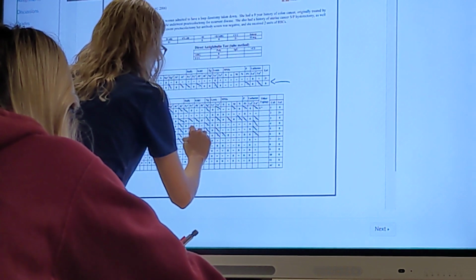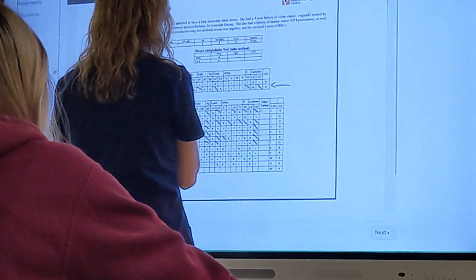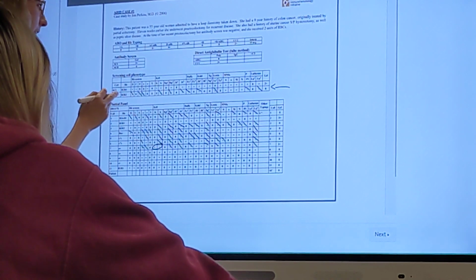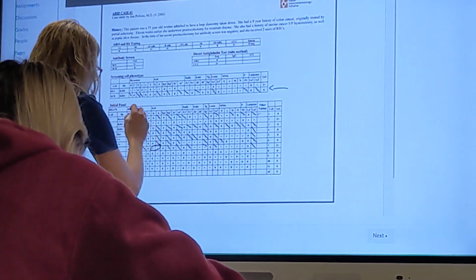Yeah. Good, that's what I want to hear. Is it possible to have two? Or is it... So, you should have one that matches the pattern. There can be stuff that you can't rule out, but I do know that this is a single antibody.